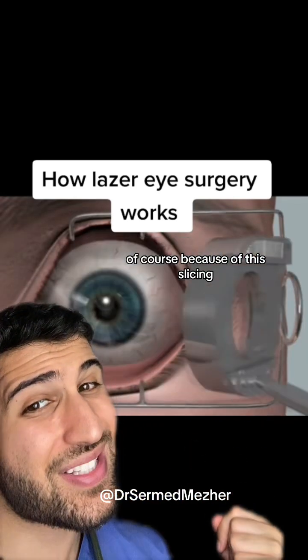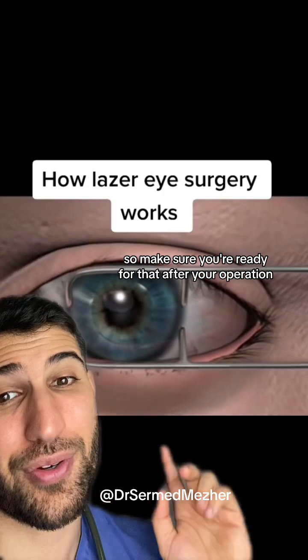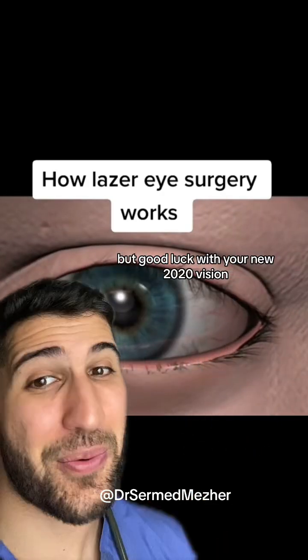Because of this slicing it can be quite painful, so make sure you're ready for that after your operation. But good luck with your surgery.